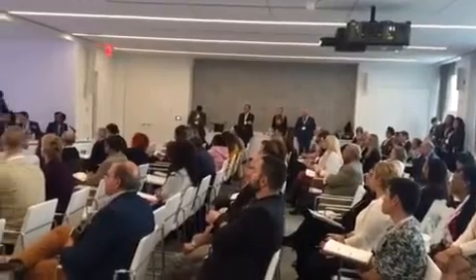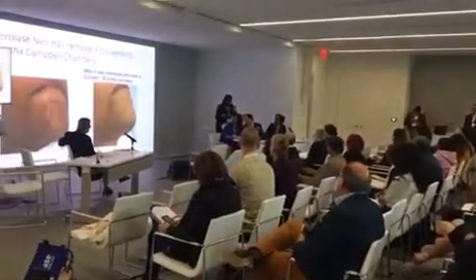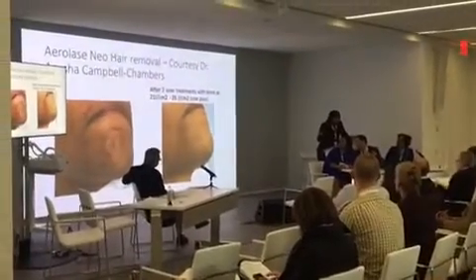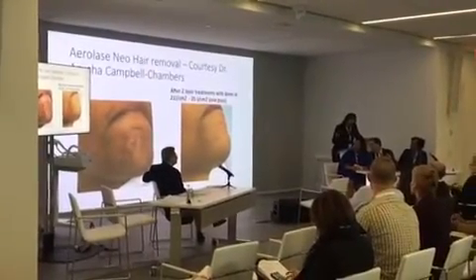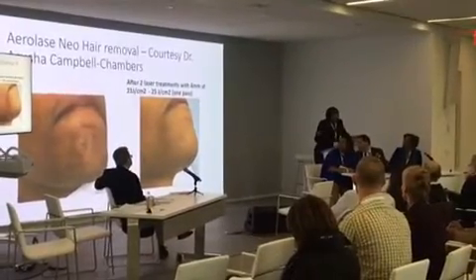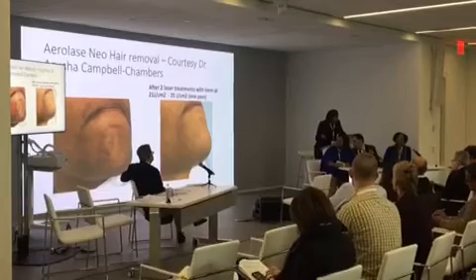Especially in men, with the density of the hair, they may have some discomfort. So I find the ice makes you feel more comfortable that your treatment is going to be safer, and it's even more comfortable for the patient. As the hairs get thinner, the comfort level is even better. Of course, with acne, I don't really have to use the ice pack, but some patients just like it anyway.